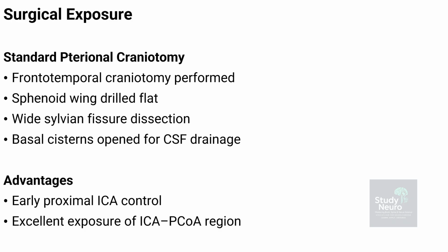The basal cisterns are then opened to release cerebrospinal fluid, which helps brain relaxation and reduces the need for retraction, making it easier to reach the internal carotid artery and posterior communicating artery region with clearer anatomical orientation. This step changes the field quickly.